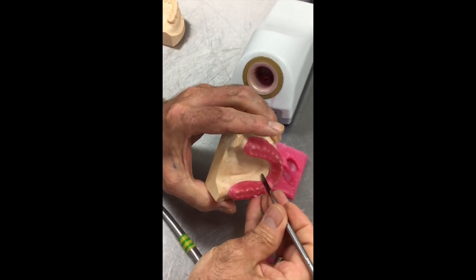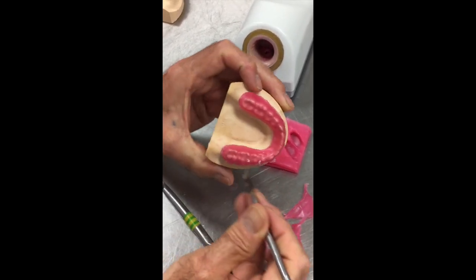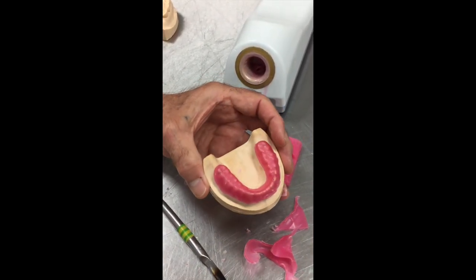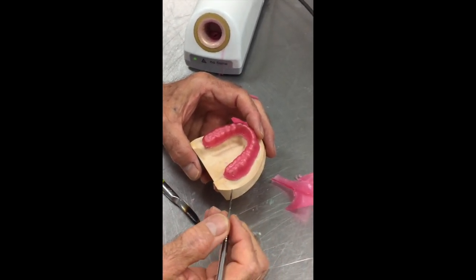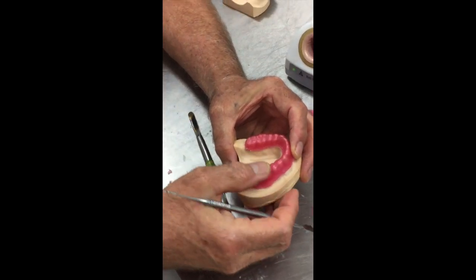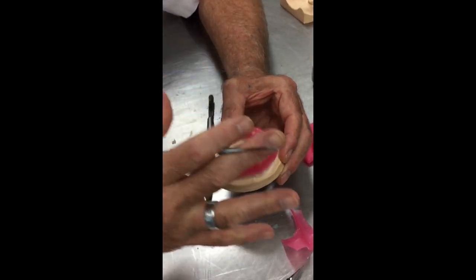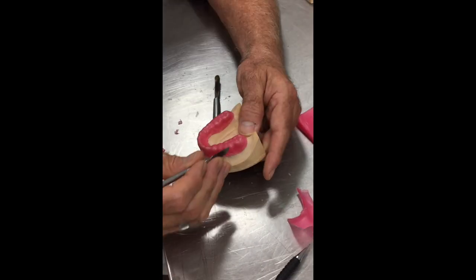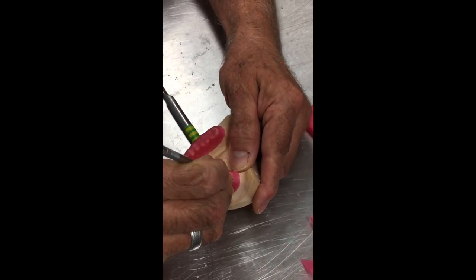We want the material to be able to flow past the edge of the periphery of the tray freely, because we no longer have the rimlock trays like we did with the old rubber-based impression materials where we required some compression. Now we prefer these materials to flow freely and then for the tray to be held in place while they set. So you can see through the tray now where my tissue stops are. I'm going to cut these vertically.